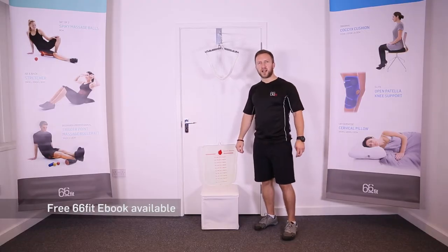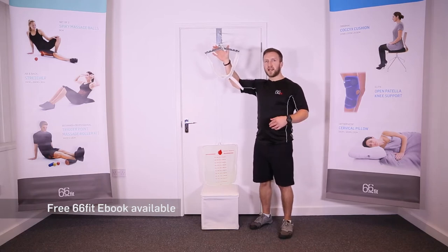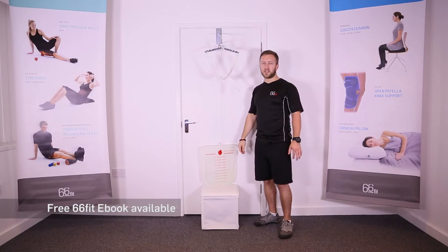This is the 66 Fit neck traction unit. This product is designed to provide traction to your neck and is designed to be used at home over the top of a door, like you can see we've got it set up here.